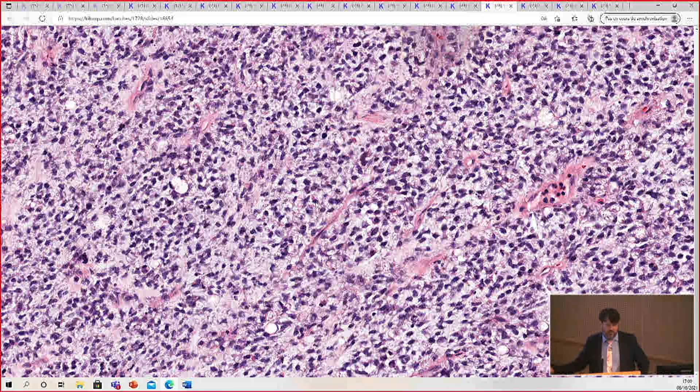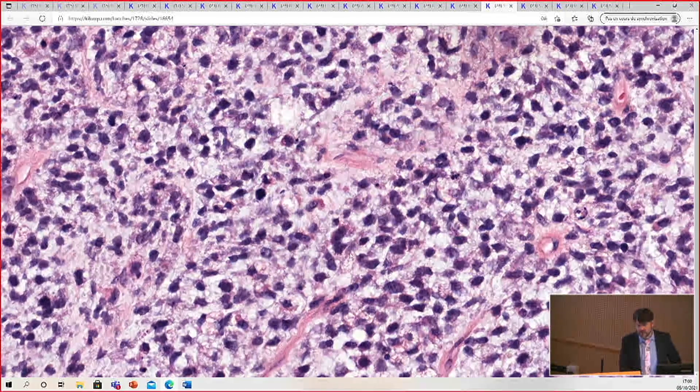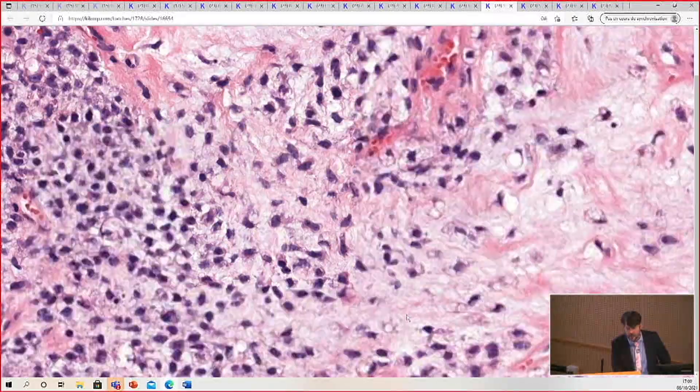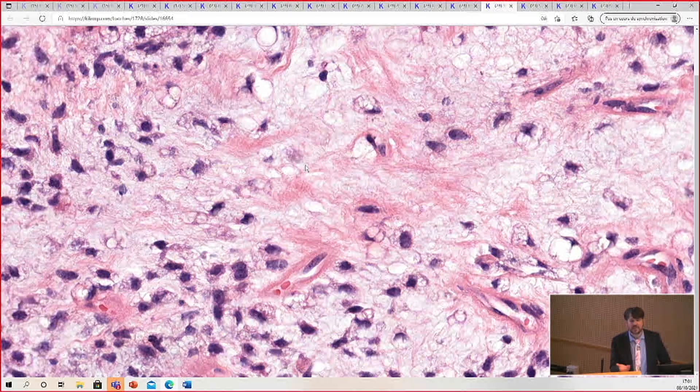It's the higher-grade version of myxoid liposarcoma. On a core biopsy, the round cell component can occasionally look like a pure round blue cell tumor, but if you get enough sample, you'll usually find myxoid change and tiny vessels in the background — and with a big enough sample, areas of obvious conventional myxoid liposarcoma. Only on a small biopsy can it mimic Ewing's or another round cell sarcoma. Also on imaging, myxoid liposarcoma has distinct radiographic characteristics, and a skilled musculoskeletal radiologist will recognize the fat and myxoid signal on MRI.